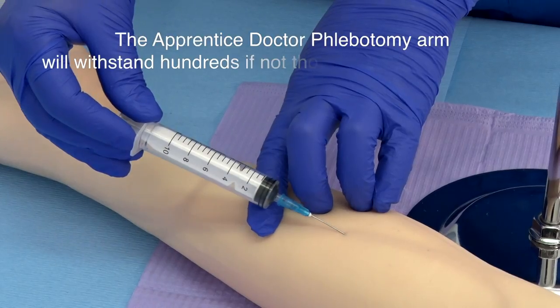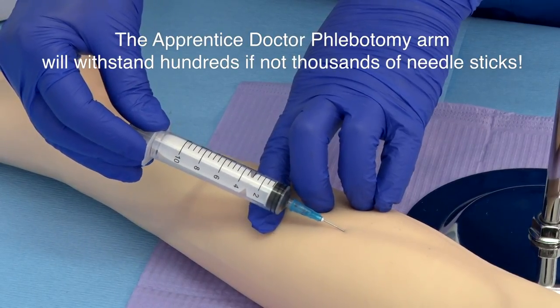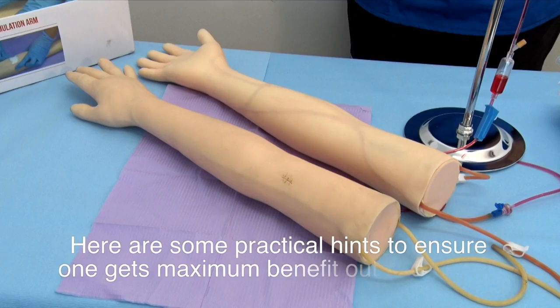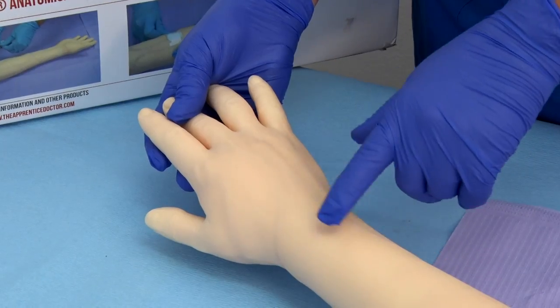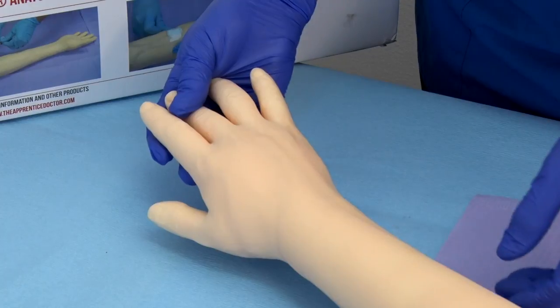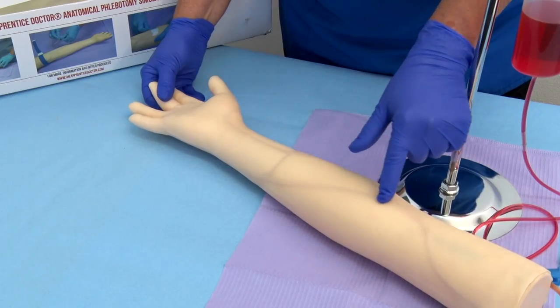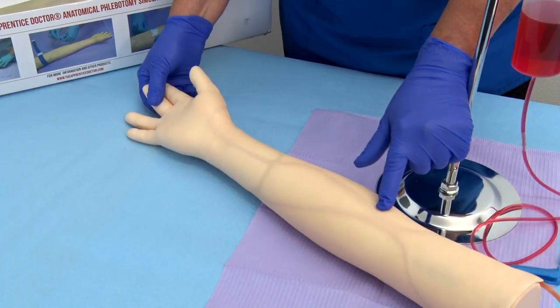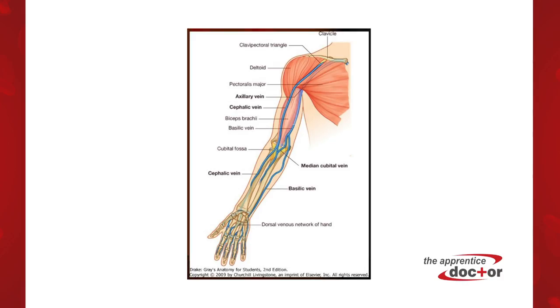The Apprentice Doctor phlebotomy arm will withstand hundreds if not thousands of needle sticks. Here are some practical hints to ensure maximum benefit. Hint 1: There are veins at the dorsum of the hand and the ventral surface of the arm — the basilic and the cephalic veins. Vary the phlebotomy puncture sites and do not overuse one specific area.